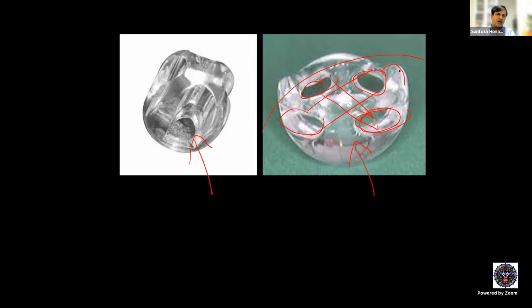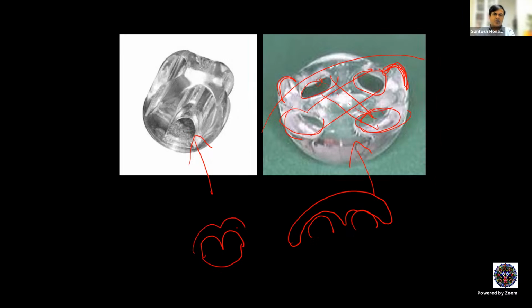But these have these sharp edges, right? Or these are called nodules or lobules. This will form humps on the surface of the socket. So when the prosthesis is made to fit this, the prosthesis goes around these humps, right? This is also a way of doing pseudo integration. So if you have a contoured socket like that, on top of that, if you fit a prosthesis, this is the anterior surface of the prosthesis, this is the posterior surface of the prosthesis. You see this posterior surface goes into the hump that is created. So that gives you a kind of pseudo coupling. These are all various phases of evolution.